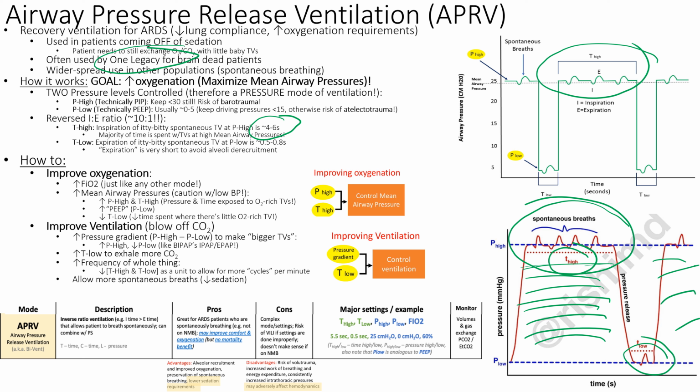Can you imagine being up there 6 seconds, and then you let go, and then it goes all the way back up again, because the time that they let them down there is like half a second. So they'll breathe about 6 seconds up top, 0.6 seconds down below, and they're always maintaining this high pressure and being exposed to all this oxygen-enriched volume. Hopefully not too much because it can cause some free radicals, but getting exposed as much as possible.